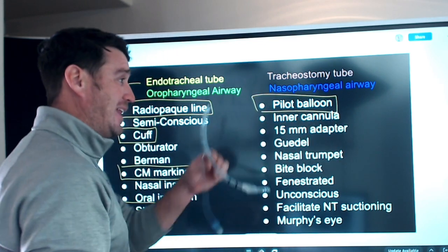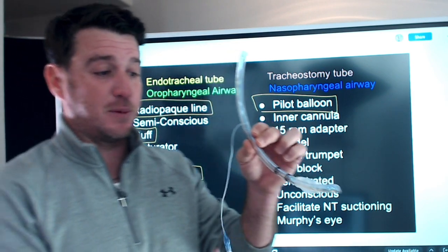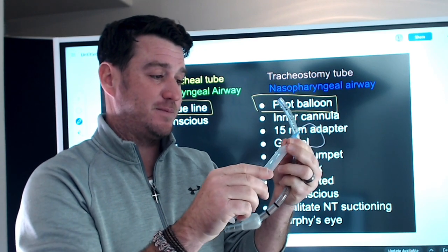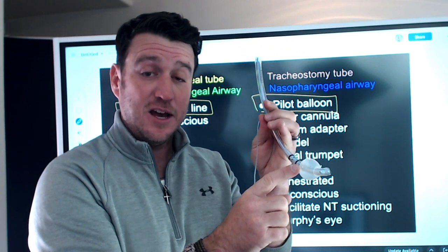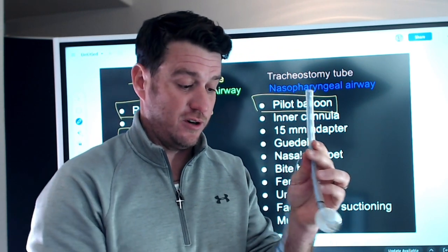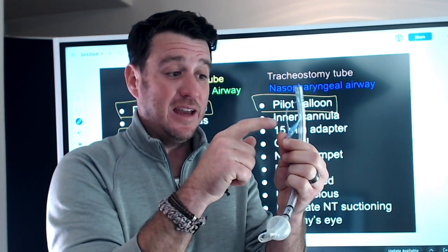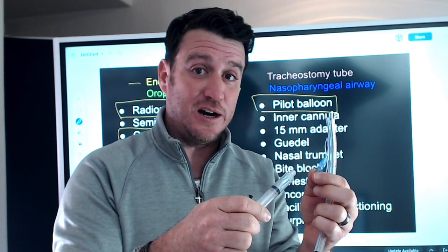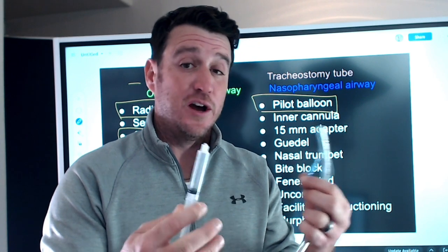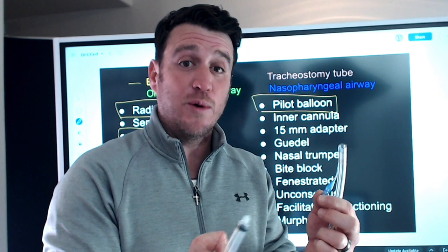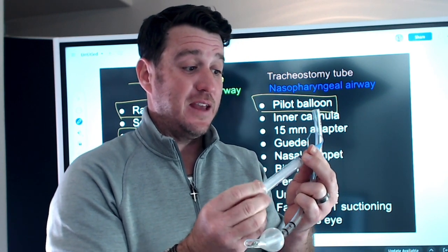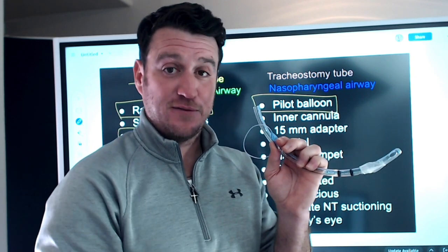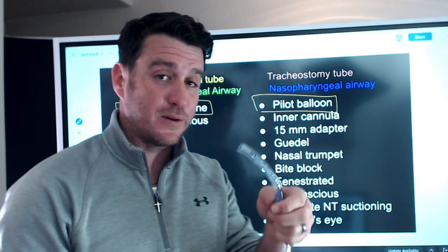Pilot balloon — 100% goes with the endotracheal tube. I'll add another 20 cc's to this cuff. We now have an inflated cuff and we need to manage that cuff pressure. The pilot balloon — this blue part — is used to evaluate cuff pressures, inflate the cuff, and deflate the cuff. Prior to extubation, we always want to fully deflate the cuff, and we use the pilot balloon with a syringe to do that safely.